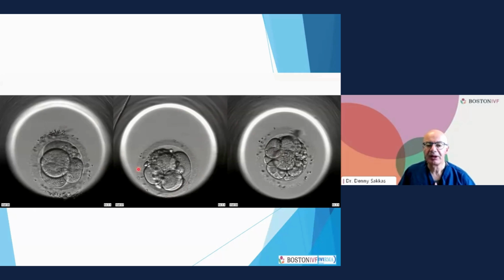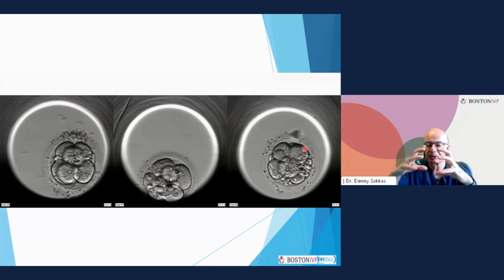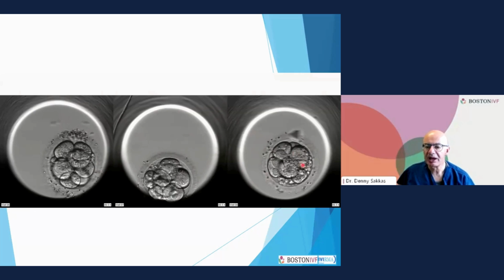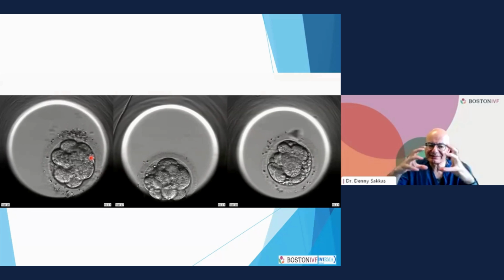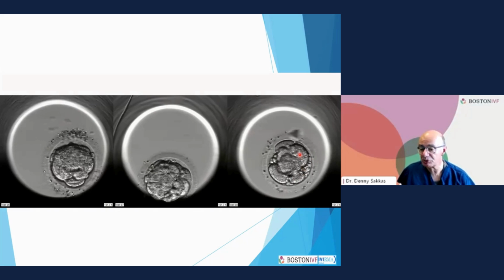But you'll see here that even though these embryos are growing in the same way, you'll see in a minute they start compacting. They'll get all together, and we won't be able to count the cells, but you'll see that 2 of these embryos will be much better than another one. You can see a few fragments here. These cells are breaking apart, but as the embryos develop, you can see this one is a little bit ahead because it's coming together. It's at the compacted stage, and you'll see in a minute that this one degenerates completely, whereas it didn't look too bad on day 3.